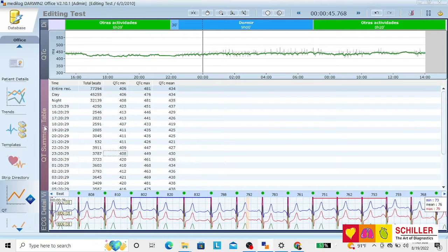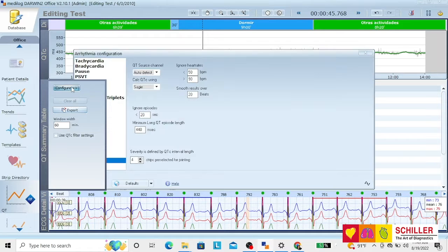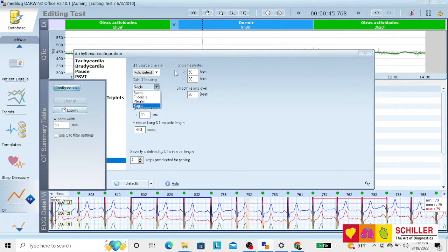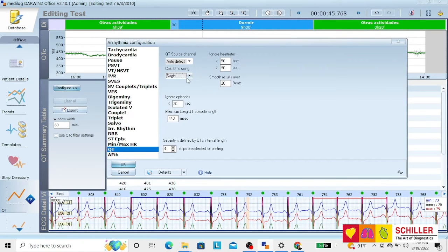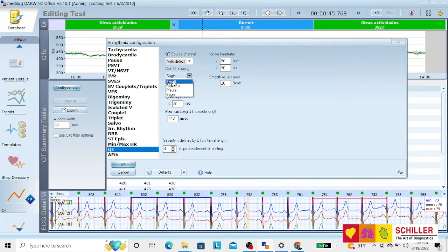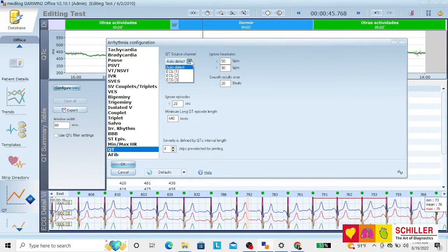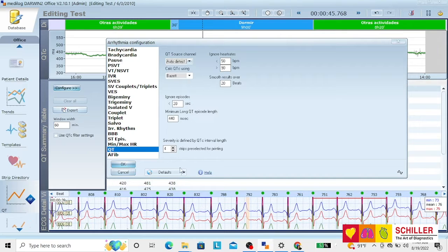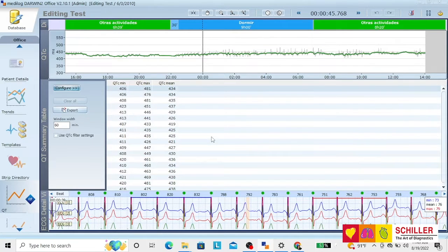If you click where it says QT summary table and go to configure, you can select which formula you want to use between Bazett, Fridericia, Framingham, or Sagie. You can change the source, either auto-detect or one channel only, length of episodes, minimum long QT, and heart rates to be analyzed. Once this is done, just click on OK and ACCEPT.